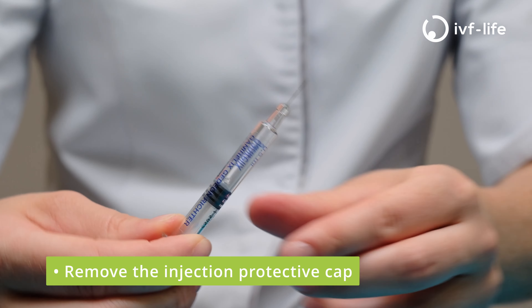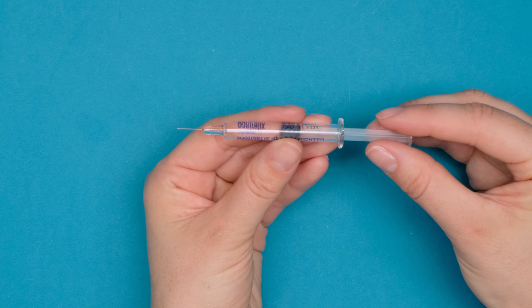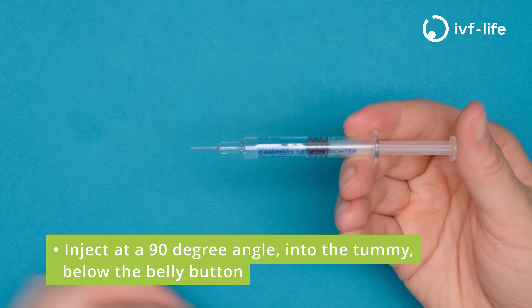Remove the protective cap and proceed to inject into the tummy just below the belly button by pushing the plunger at 90 degrees.